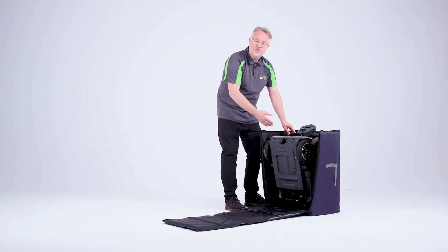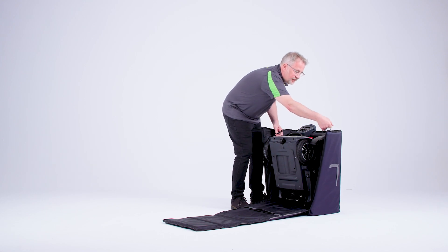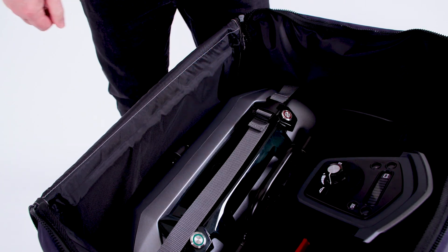Once the X-Go Nano is within its bag, there are some securing straps. They're located on either side, and you place them over the Nano and click into position.